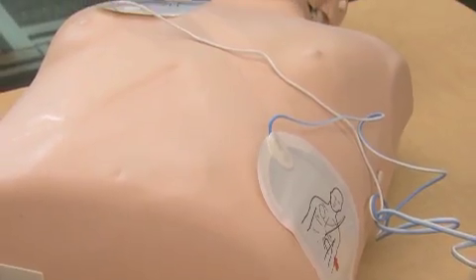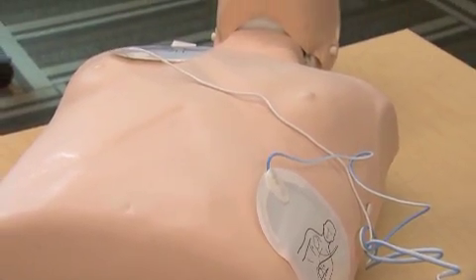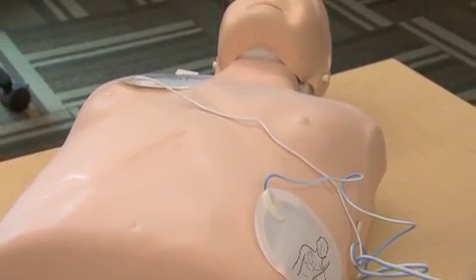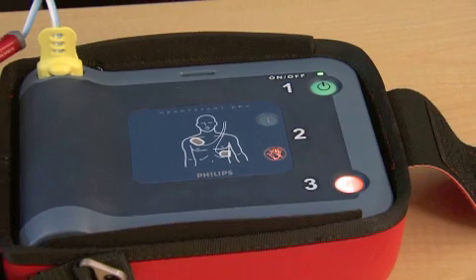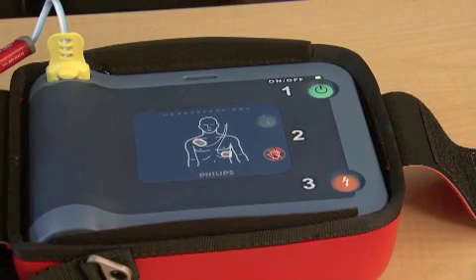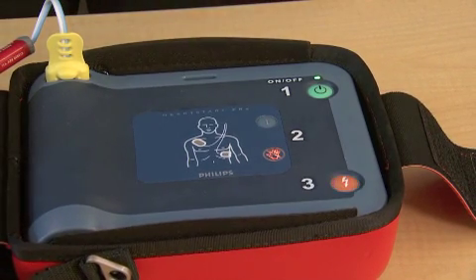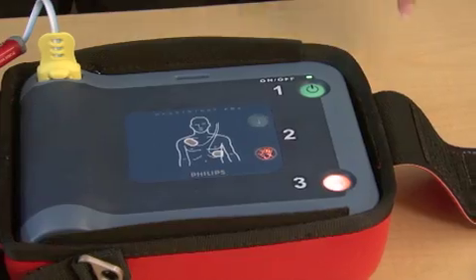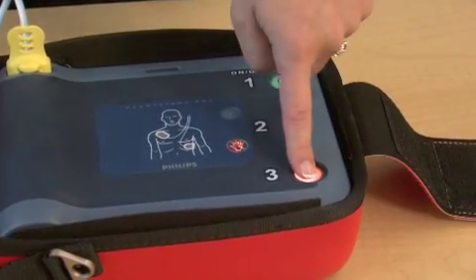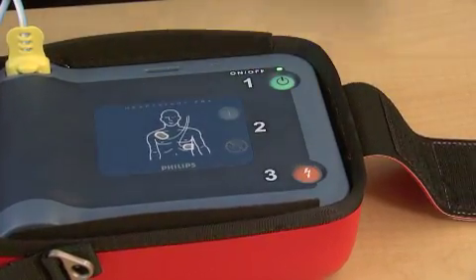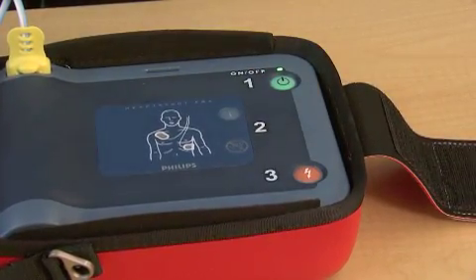Stay clear of patient. Analyzing heart rhythm. Shock advised. Stay clear of patient. Press the flashing orange button now. Shock delivered.